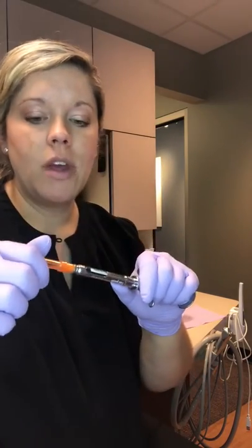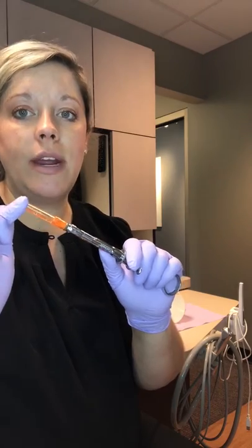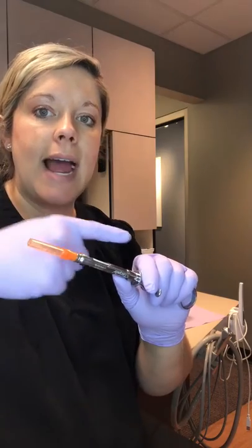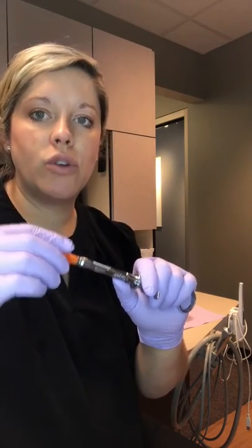We're going to demonstrate how to unload the syringe. First thing you want to do is unscrew the needle. When I unscrew a needle from a syringe, I grab the cap and I press down as I unscrew it.